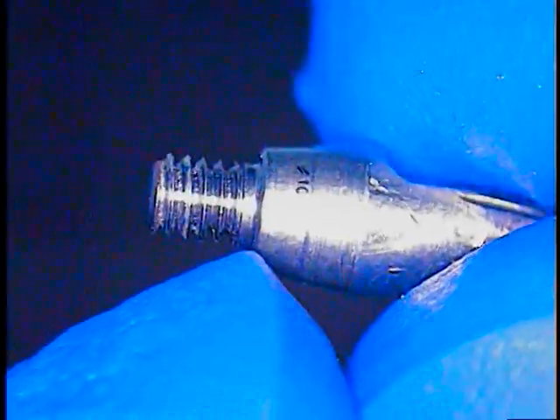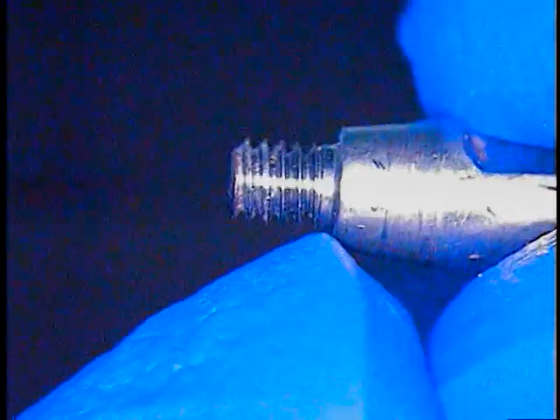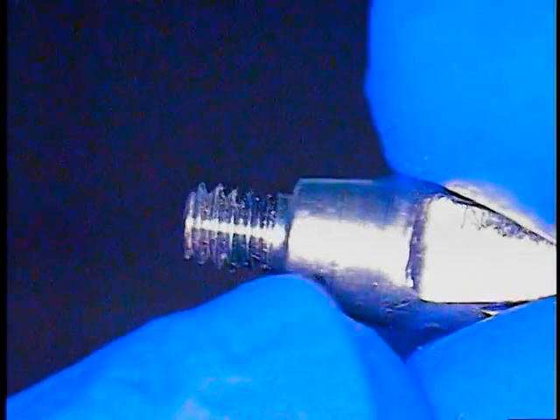Take a look at the design of the solid abutment. This is a used solid abutment, but just below the solid portion — what they call the Morse taper — you can see there's a zone. It's not very long at all; it's about the height of one thread. That zone has to be penetrated, and then we can take the middle portion out by just thinning it, and hopefully the threaded portion will come out.